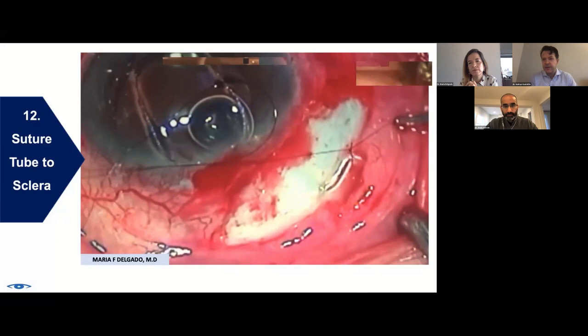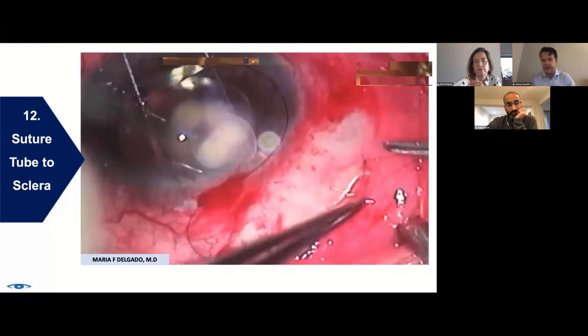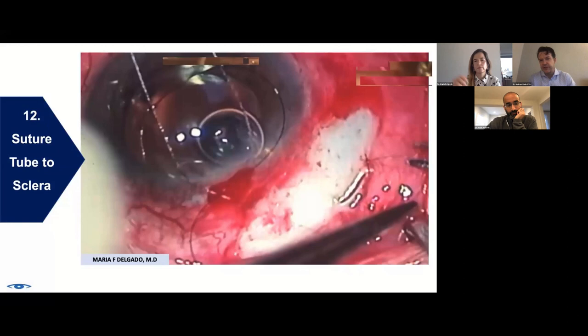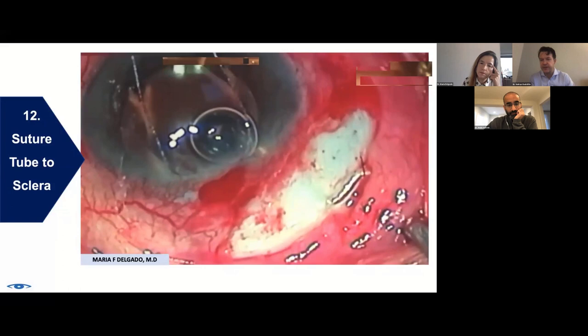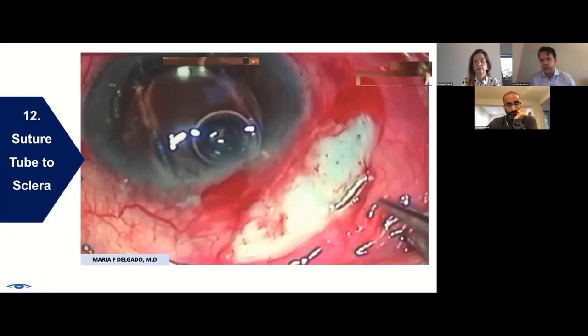I'll make a few comments. First of all, it's a very wise thing to make that type of track that you have there for so many reasons. Number one, if this patient ever needs a reoperation, you've got extra tube length to play around with. If they have an erosion, and erosions happen in some number, 2% of tubes, something real, you'll be able to reposition, come in through another quadrant, and that extra length is good. You'll have a tube that's much more stable.